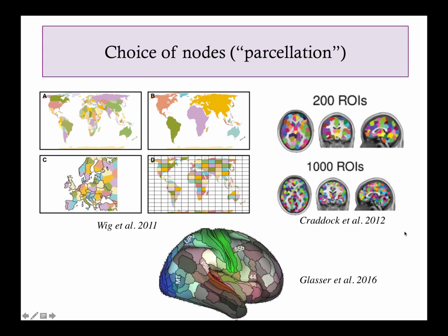One of the key parts of this analysis is how we choose our nodes. This will really affect whatever we get from the data. If we're defining nodes for a whole brain analysis, we'd like to carve up the brain into meaningful functional units rather than arbitrary boundaries. If we just randomly carved out boundaries, then at the end of the day, we'd run some analysis and get results that might give you no information at all.